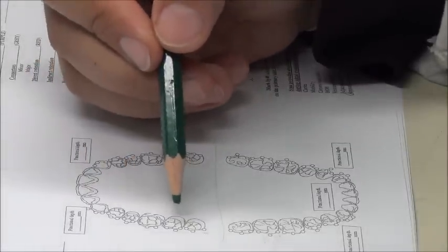Other than clinical examination, we also examine occlusion on abutment teeth because we want to see if there are tight occlusion contacts. We could see it in the patient's mouth, or when we articulate the upper and lower cast, we can see them on the articulator. The idea is, wherever we have tight occlusion contacts, sometimes we prefer not to rest on that area, not to put a rest on it. So these are the findings. Other findings, the chart also includes them, not to forget them.